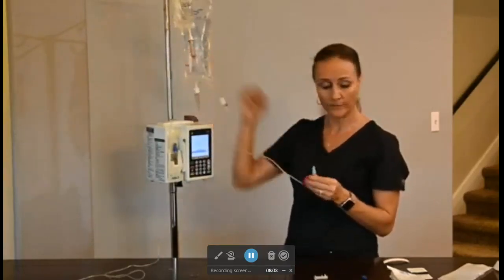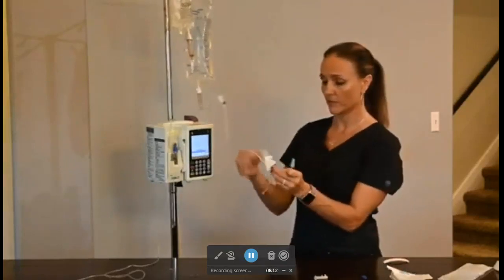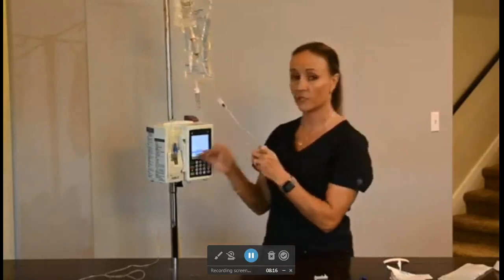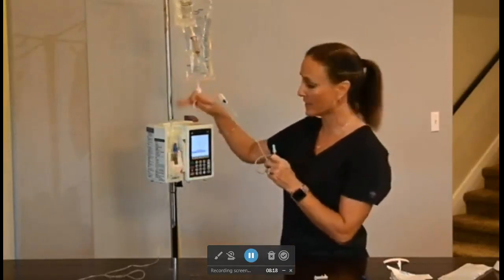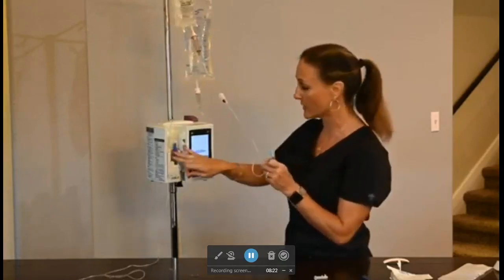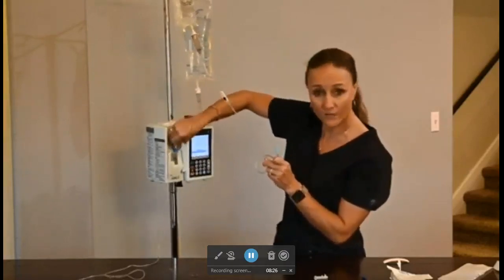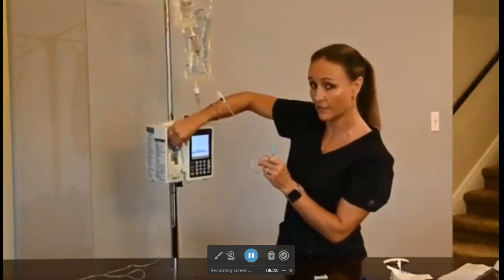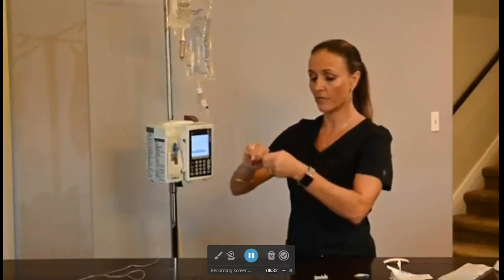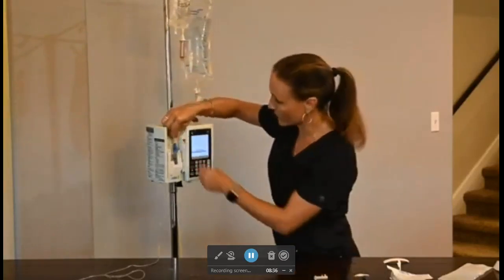So now I have a cap on the end of this one. When we talk about piggybacks, that means that we're going to connect it to the port that's above the pump. Now, I know this isn't really above the pump because it depends on the type of pump that you're using, but this is above. I would come over here, I would scrub, again, I have gloves on, for 15 seconds. Then I'm going to take off my cap, come over here, it's a little ridged area, I'm going to push and twist it on.